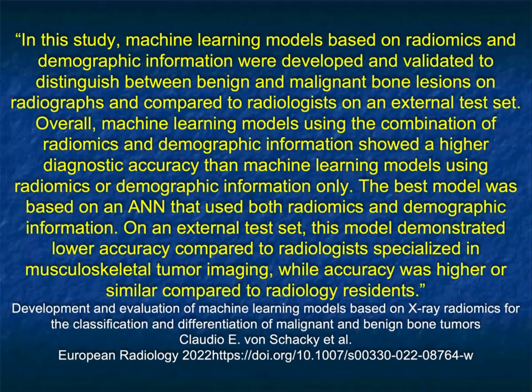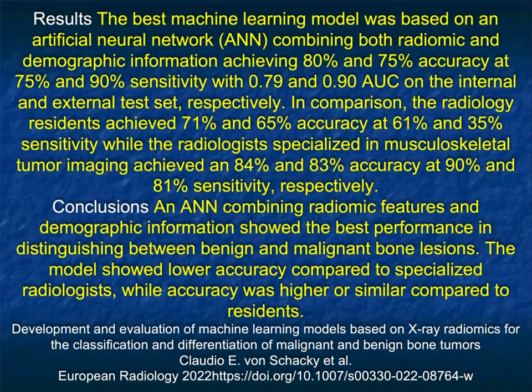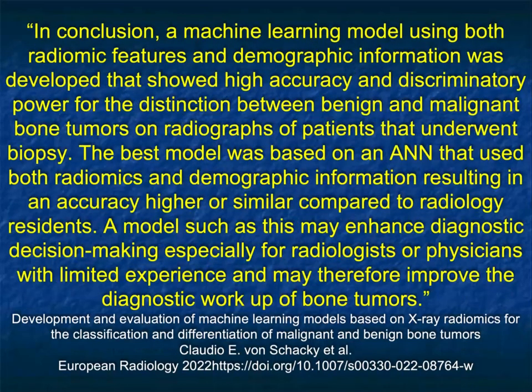Now, in their initial work, the model was lower in accuracy compared to radiologists who were musculoskeletal specialists, but they were higher or similar to radiology residents. So it's not perfect yet, but you can see that it's getting there. You need more cases, of course. Their accuracy was reasonable, but not as good as specialists. But again, it's a work in progress, and you can see what people are looking at and where things are going.